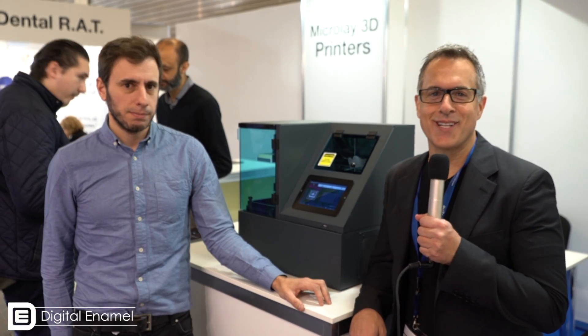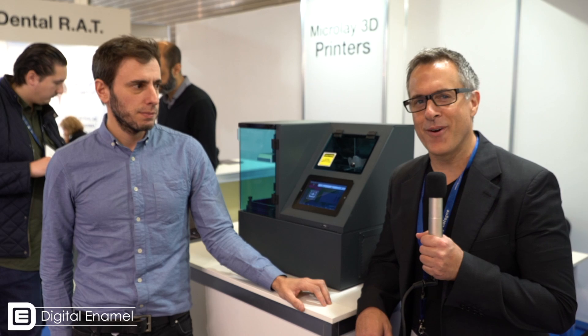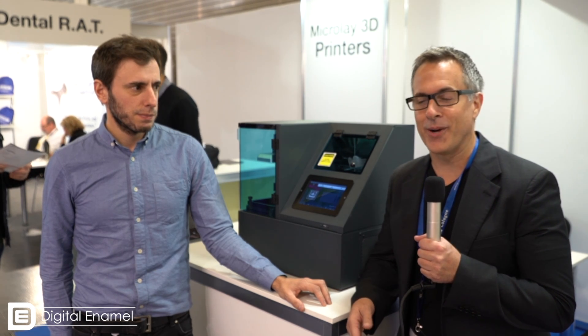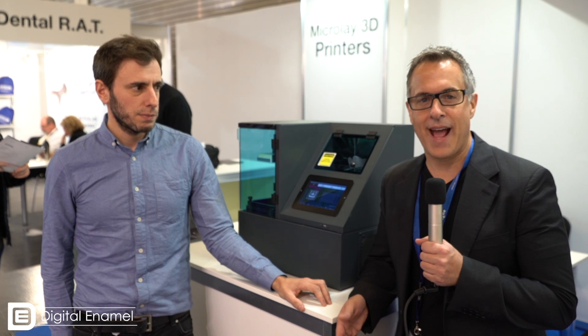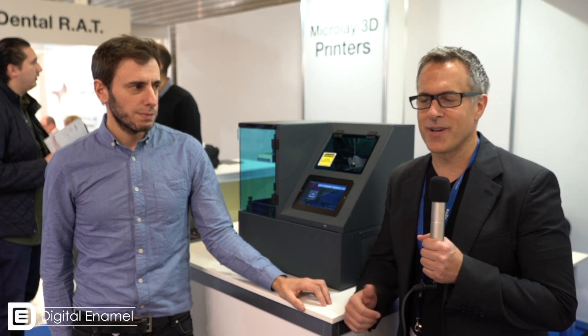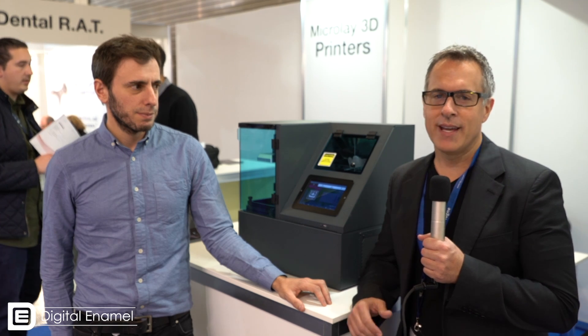Hello everybody. This is Dr. August D'Olivera with Digital Enamel. I am here at the Microlay booth with Miguel, and I'm excited to talk about this DLP printer. I personally own this printer — I just got it a little while ago. Dr. Jonathan Abenheim, if you guys know him, he's a great personality. He's on Dentaltown, he's on Facebook. He has a teaching center called the Smile Syllabus, and he's distributing this in the U.S.